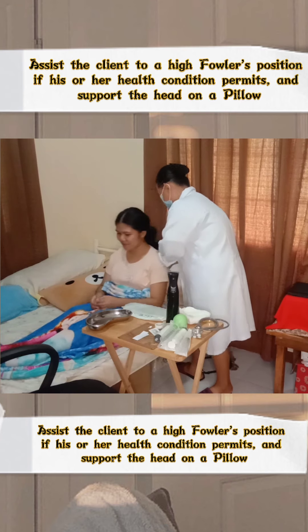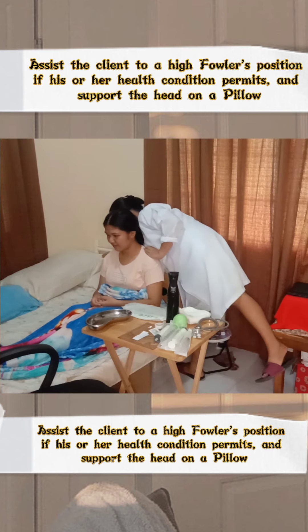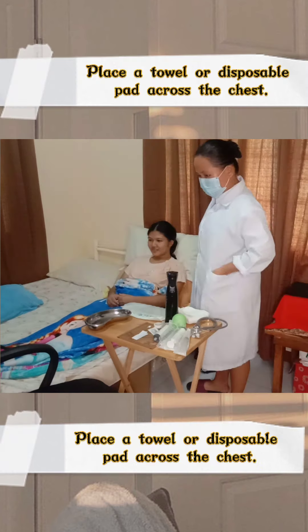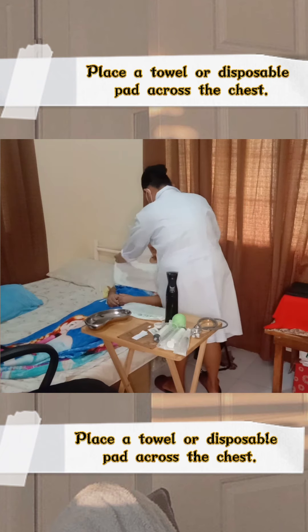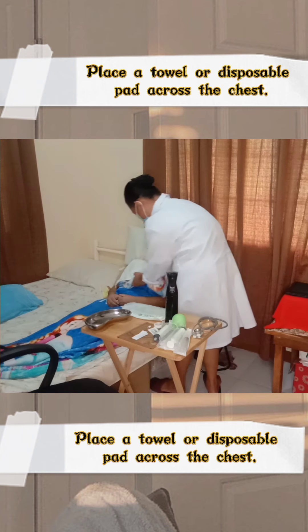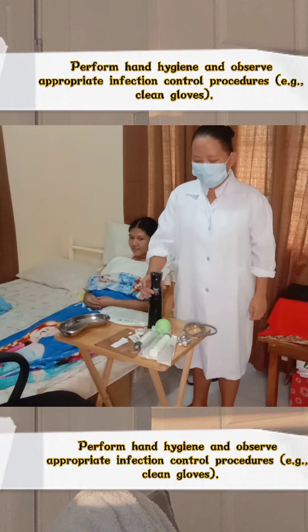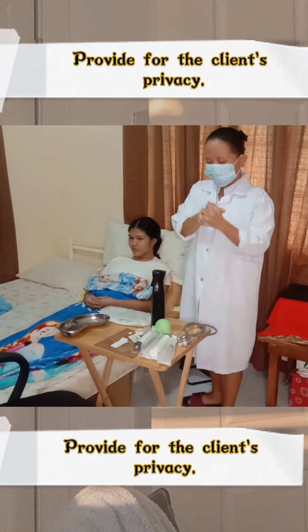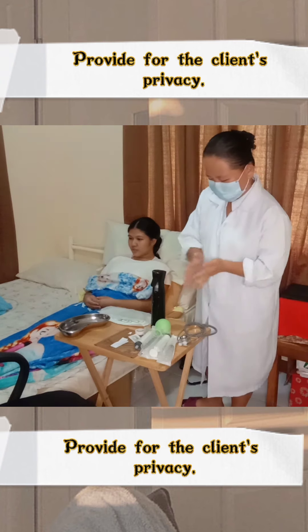Assist the client to a high-Fowler's position if her health condition permits and support the head on a pillow. Place a towel or disposable pad across her chest. Perform hand hygiene and observe appropriate infection control procedures such as using clean gloves. Then provide for the client's privacy by closing the curtains or the door to the room if possible.